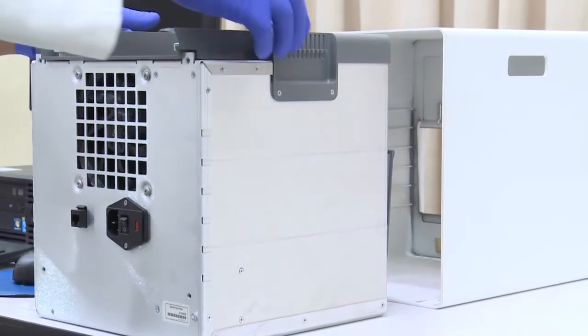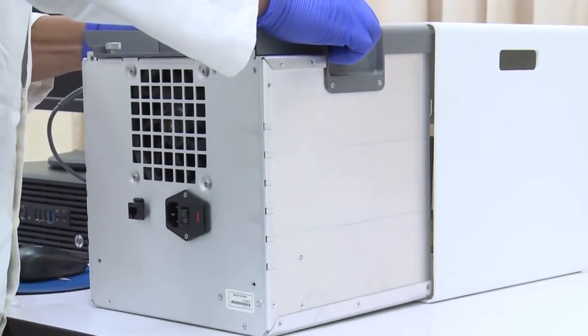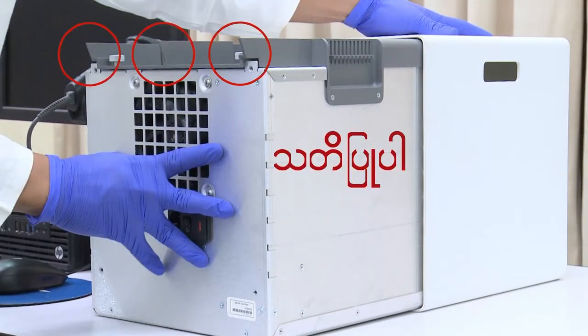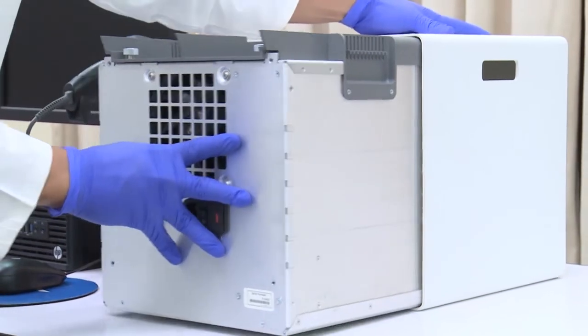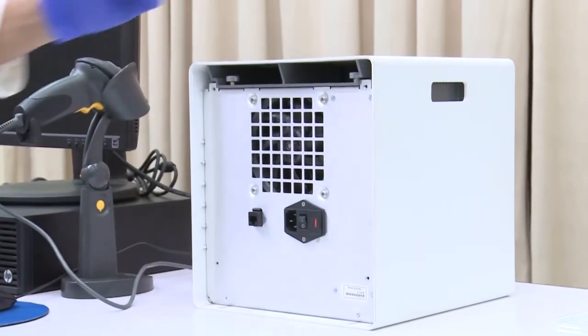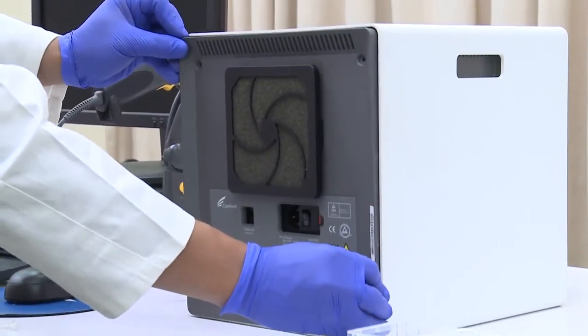After cleaning, insert the machine body into the outer cover by pushing from the back to the front as shown. Reassemble the fan filter and install the back cover.